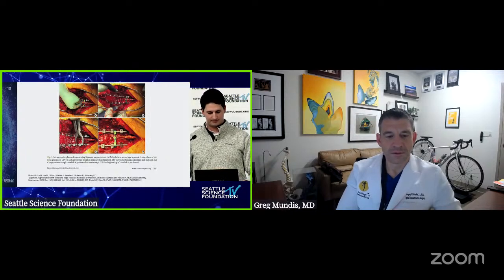Just very quickly, for anyone watching who hasn't seen it before, this is a technique from the Neurospine Journal from 2021. It's the technique we use for the Mersilene tape at the UIV+1. Normally, we did up to +2. So for anyone who's watching, this is a nice reference.